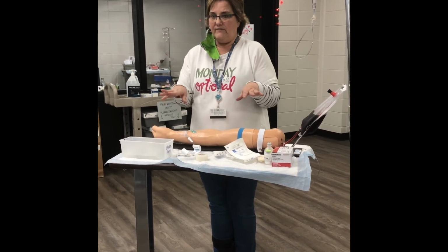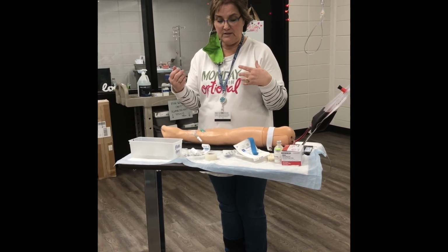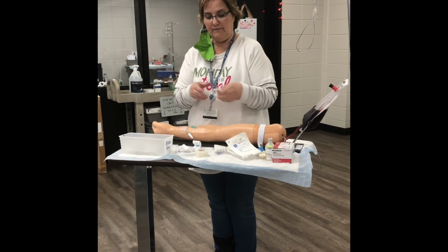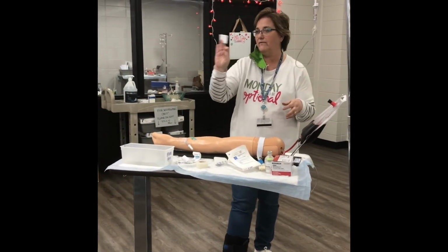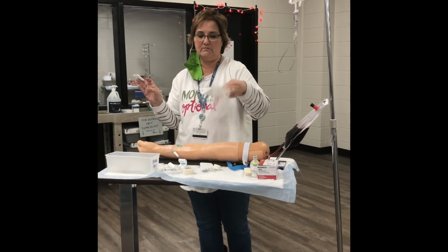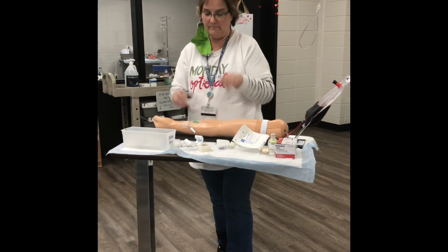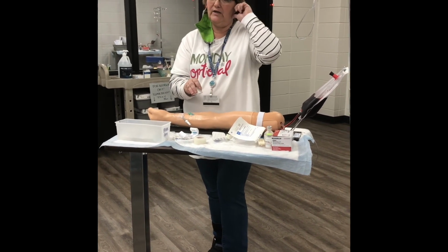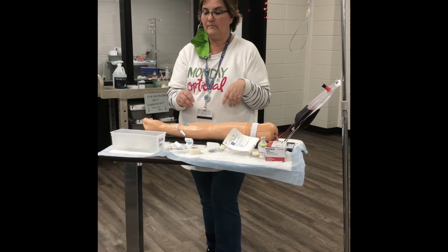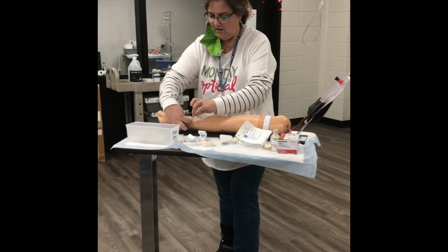And then lastly, you'll have to take it out. So you'll need gloves, of course. You're gonna need either a 2x2 or a cotton ball. For this, you'll have these little 2x2s. They come in your start kit so that you could anchor the site sometimes. Whatever you're gonna put over it after you take it out. Put your gloves on. Go ahead and get all this tape off from all of it.